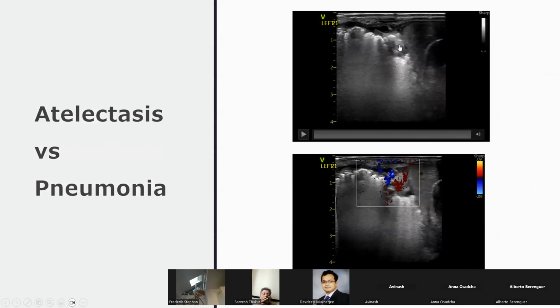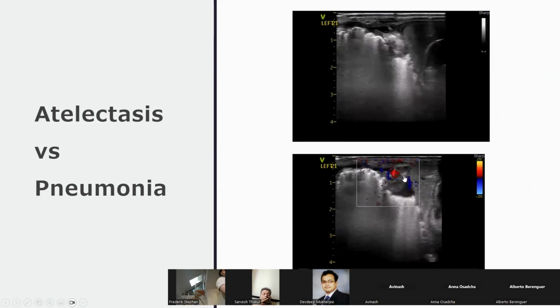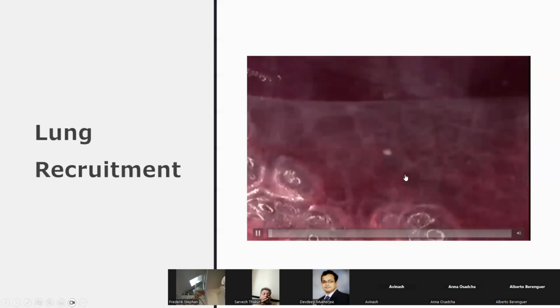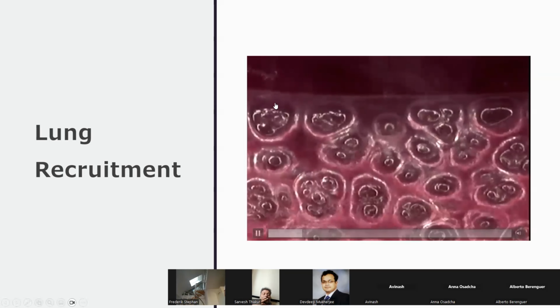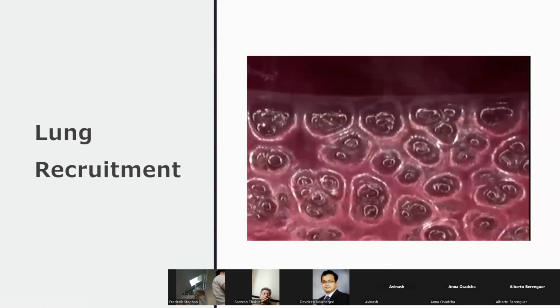On the other hand, in this baby, a recruitment maneuver might not work. Now, you can't see pleura here, but it's dominantly consolidation that's the problem. So really, that's why pattern recognition might be helpful. But more importantly, when you increase your PEEP, you recruit more alveoli, you'll then start to establish a pleural line. And traditional adult models have worked on increasing pressures quite rapidly, I would say by PEEPs of 1 to 2 every 30 seconds.